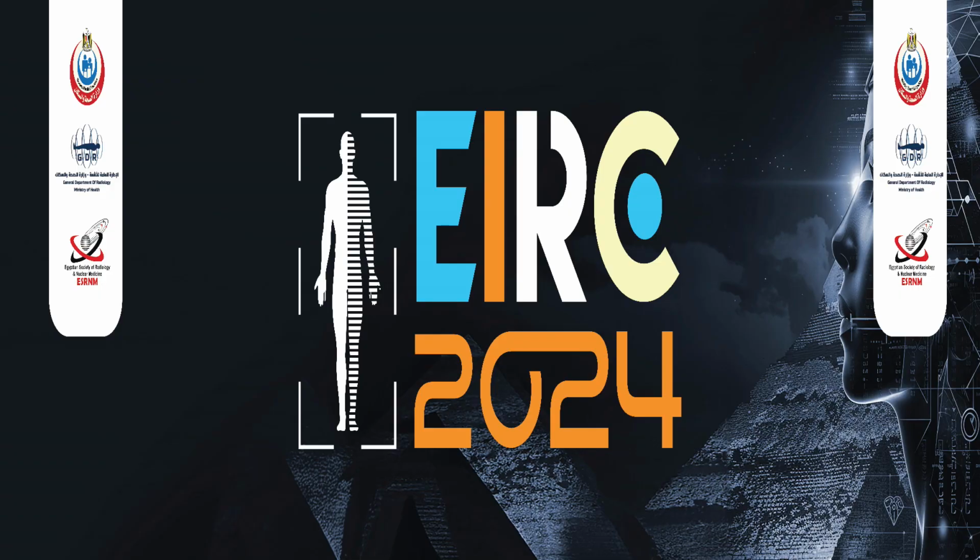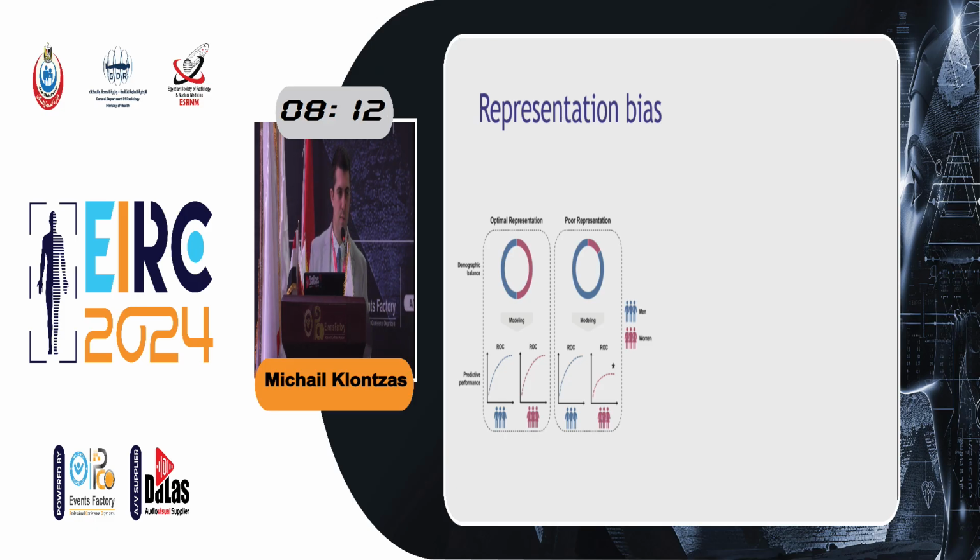Okay, so if you can create synthetic images, you can solve problems that we have in radiomics analysis. One of those problems is representation bias. If you try to predict what happens in a disease that has low prevalence, and you train your data using a different prevalence in the training set compared to the prevalence of the disease in the test set, you may end up having fake predictions that are not correct when you try real-life applications of those models.